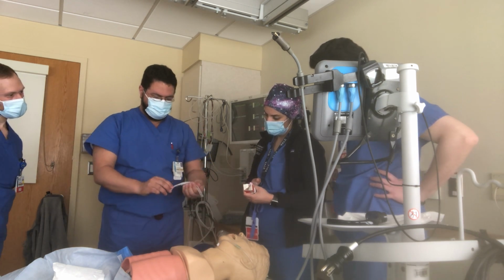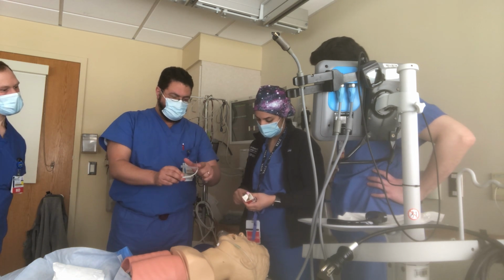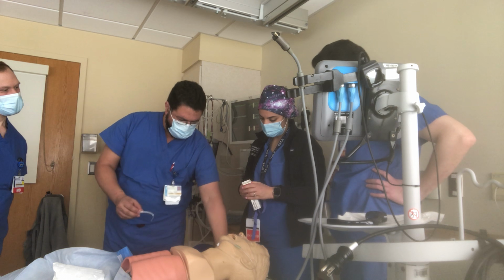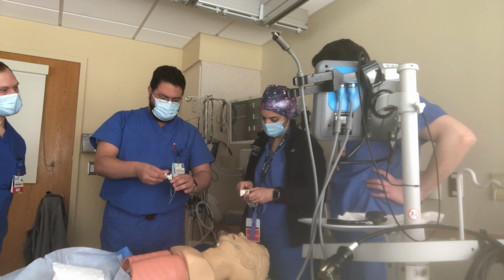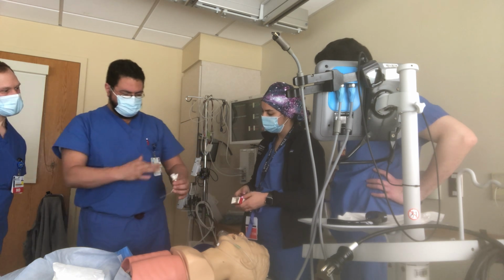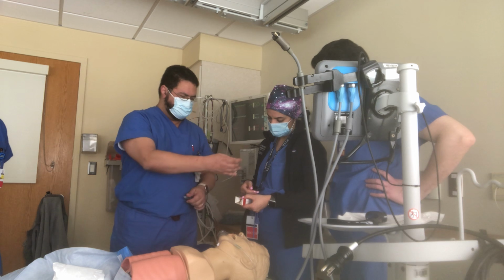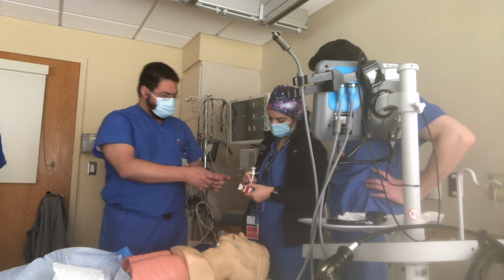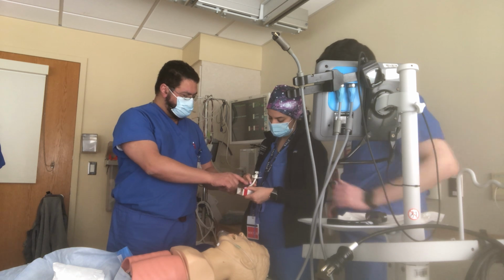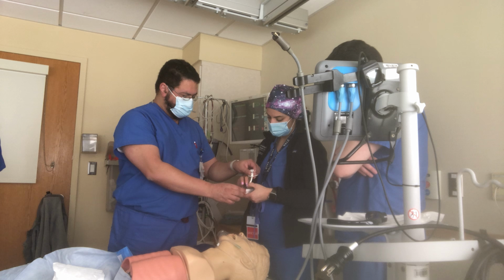This one here. Okay. This comes as a wire and a dilator at the same time. It goes inside the endotracheal, the cric, like this. And we're gonna put it through. But it's gonna stop, right? So what are we gonna do? We're gonna break it like you've done. You're gonna break these two apart. Apart. Yeah, remove them completely.